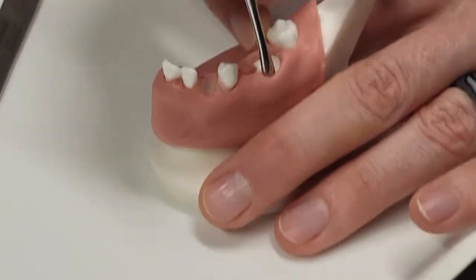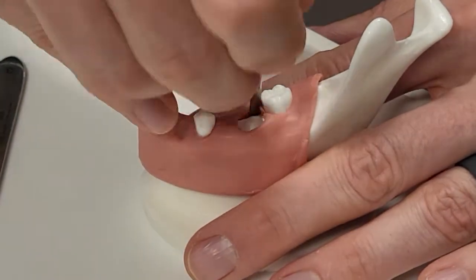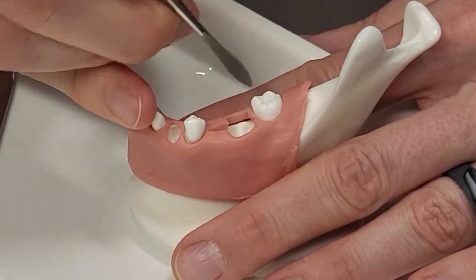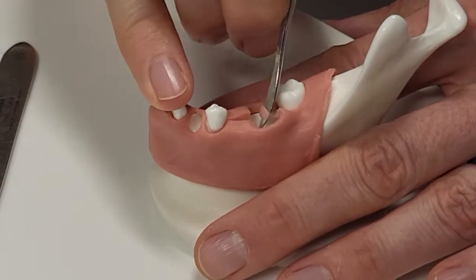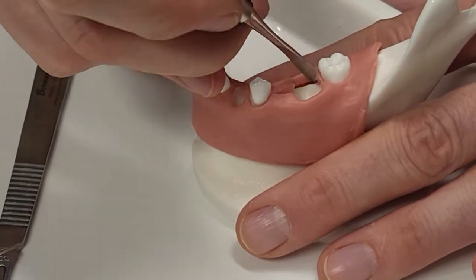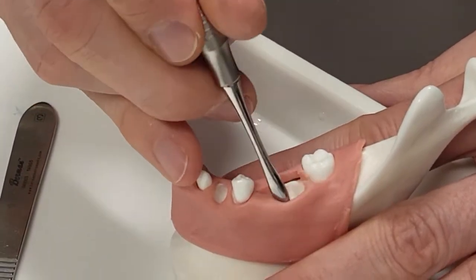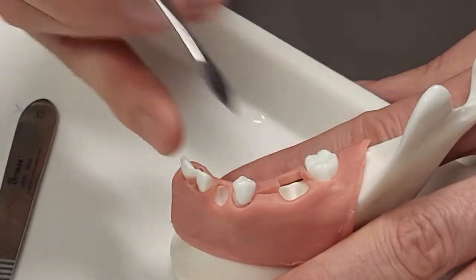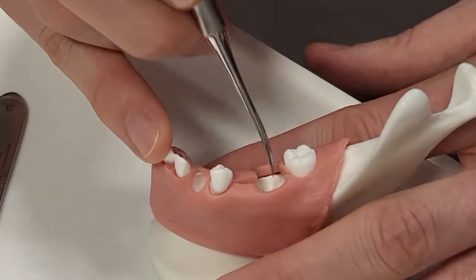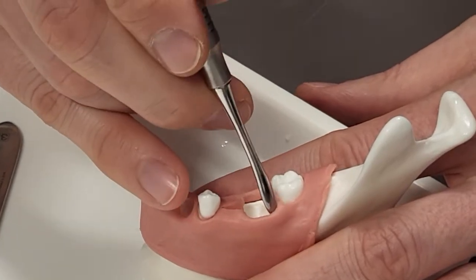We've got that set out and we're going to do the same thing on the lingual — full thickness flap, bring it all across. That little inter-papillary gingiva comes out there. You've got your full thickness flap, then you take out the tooth. Ideally you section all the way down to the interradicular bone and go past it. Then you take them out one at a time. Easy peasy.